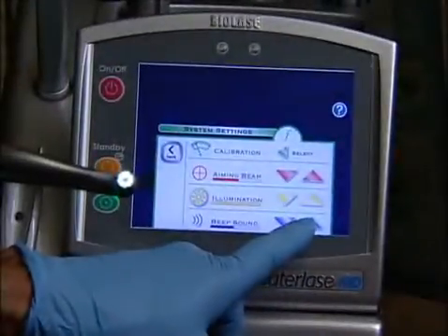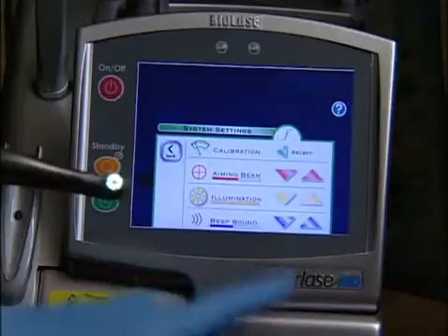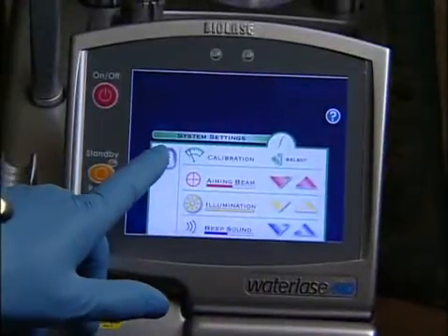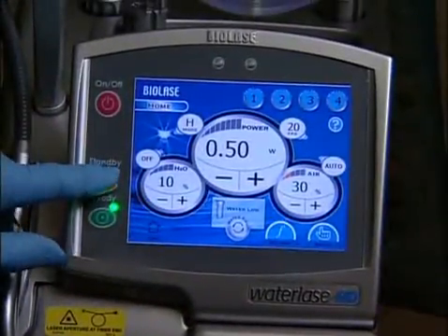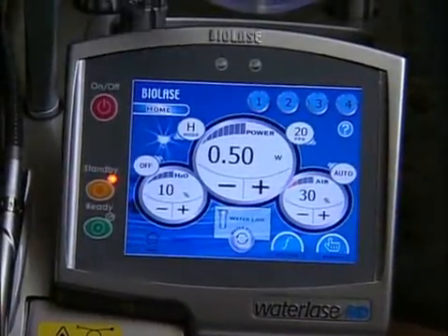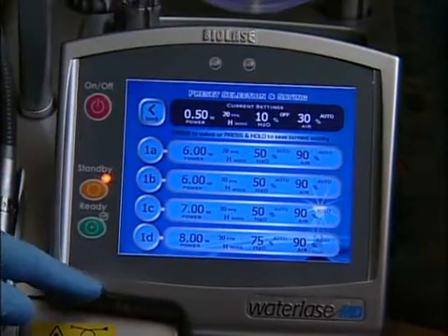And then you can adjust the sound from low volume to high volume, and I have mine set in the middle. You can go from settings back to your home screen. In the home screen, we have four different presets, and in those four we have a series of four.